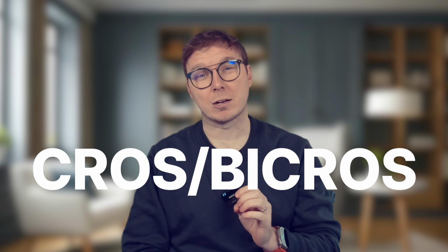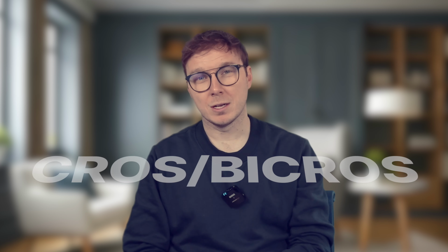Now we move on to the third new feature. Finally, we have a CROS BICROS system from Resound. This is something I've personally been waiting for a long time, as it's been a big omission in the Resound platform in my opinion. I'm glad they finally decided to address this. Now, a CROS or BICROS is specifically tailored to address the unique challenges faced by those who have unaidable hearing loss in one ear. So they have no hearing at all in one side.